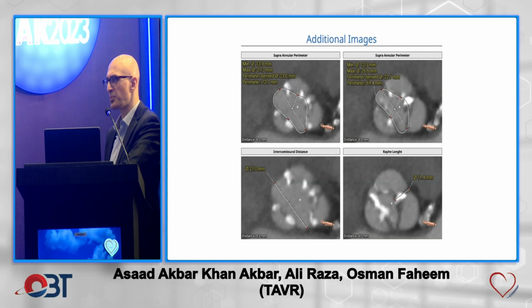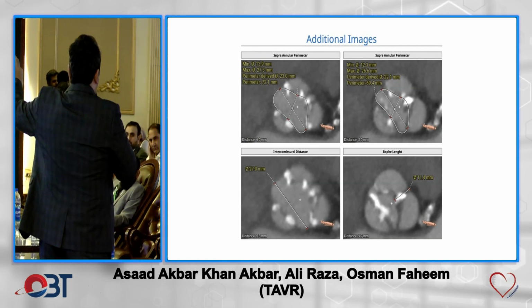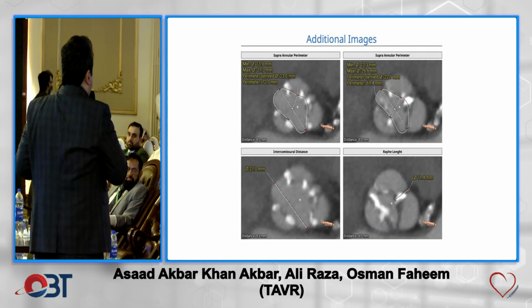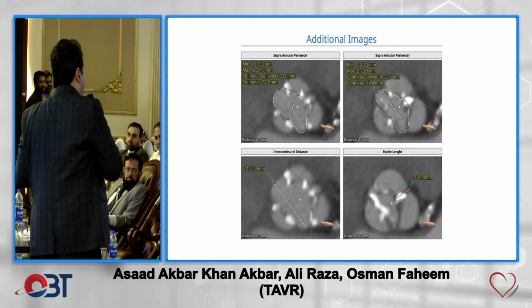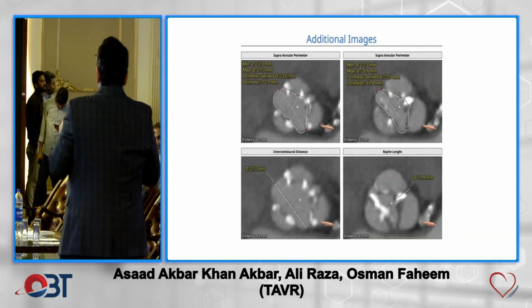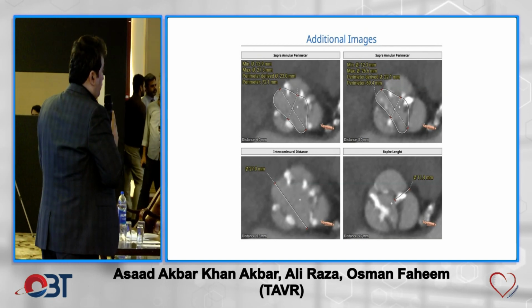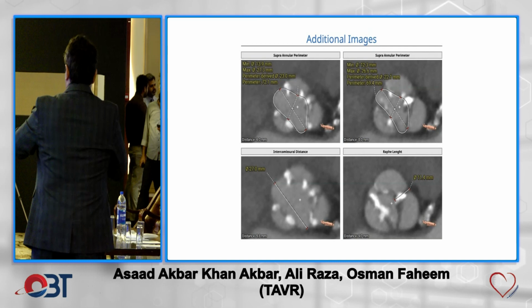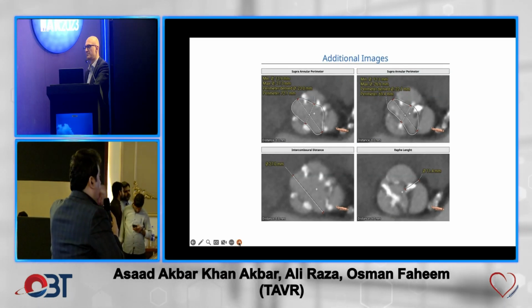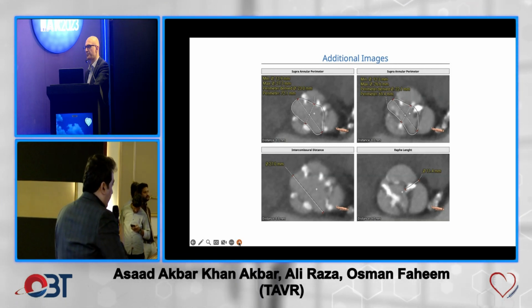I think मेरा क्या ख्याल है, देखिए जी कि bicuspid जो valve है ना, that will always end up a bit of a fish mouth type. It will never become circular. आप जो कुछ भी कर लें ना, तो ये रैफे तो आप उसको खोल तो नहीं सकते हैं, ये कभी भी स्प्लिट नहीं होगा ये रैफे इसके लिए. तो इसीलिए अगर आप सपोज करें, स्पेशली अगर it ends up to 34, फिर तो मैं थोड़ा और भी कॉशियस हो जाता हूँ, क्योंकि 34 में इन फोल्डिंग का चांस ज़्यादा होता है for these valves. सो आपने ये बहुत ख्याल रखना है कि अगर 34 पे आप जा रहे हैं तो मेरी तो सजेशन ये कि downsize it if it's in the borderline category.